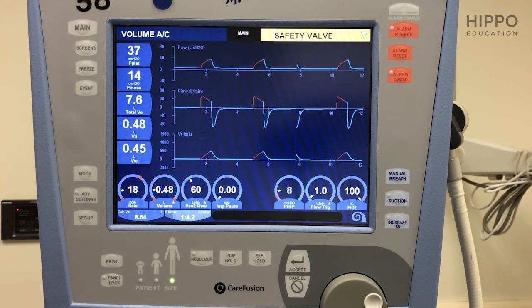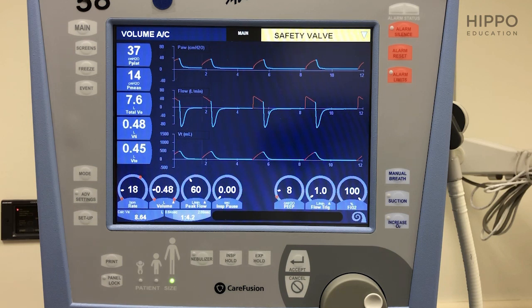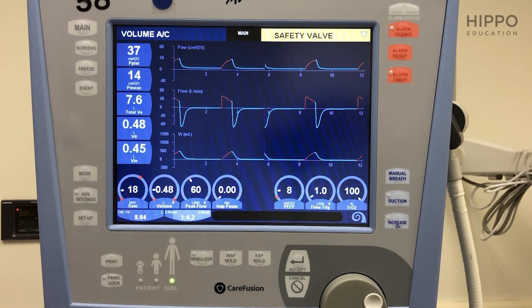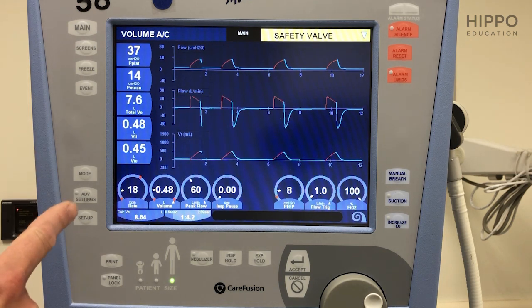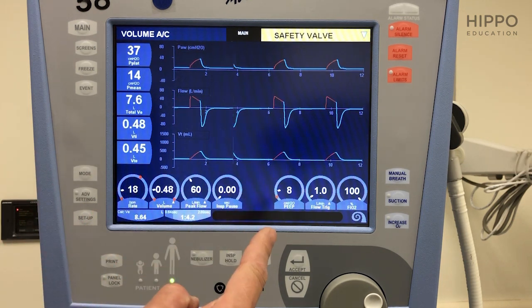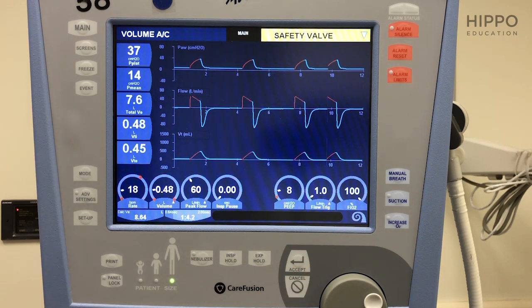You can use that plateau pressure number to make decisions — do I need to decrease my tidal volume? What adjustments do I need to make for this patient's current lung health? And that's pretty much it. Basic vent management: make sure it's plugged in, make sure there's oxygen, make sure you're on volume assist control. Your four parameters — respiratory rate, tidal volume, PEEP, FIO2 — and how to adjust them with a toggle. And then how to find your peak pressure and how to do a plateau pressure.